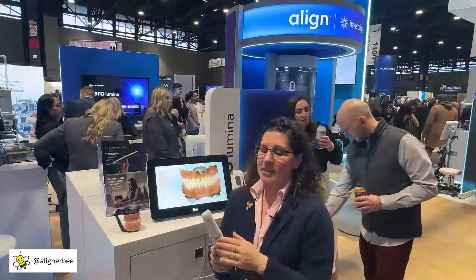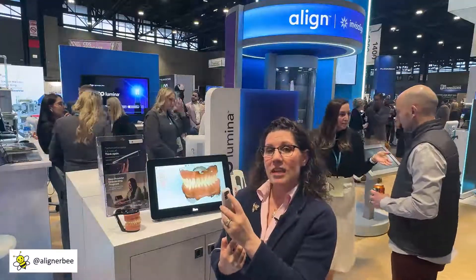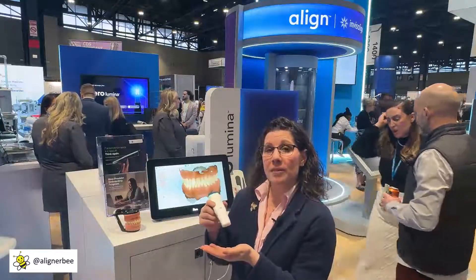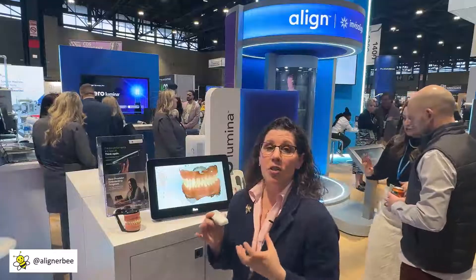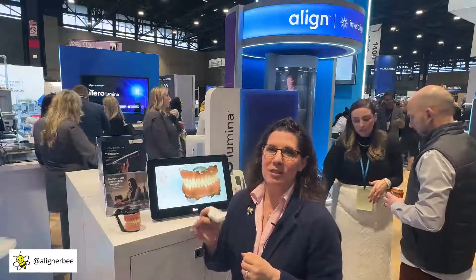In the new style and design, there are six cameras. So when scanning, you have the ability to be a little bit farther away from the teeth, which is going to capture a larger field of view and increase the speed of your scan.